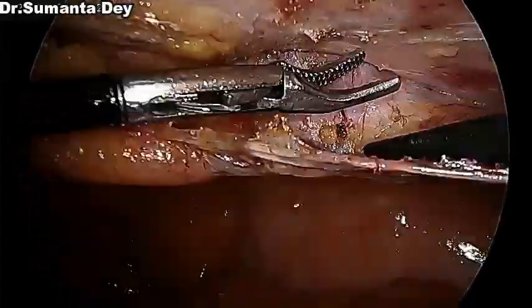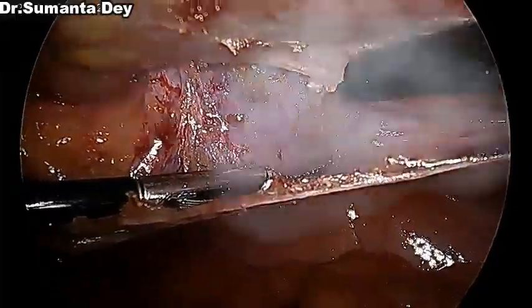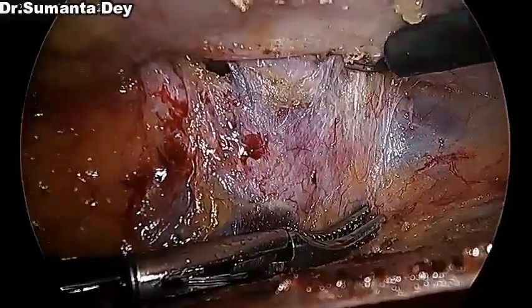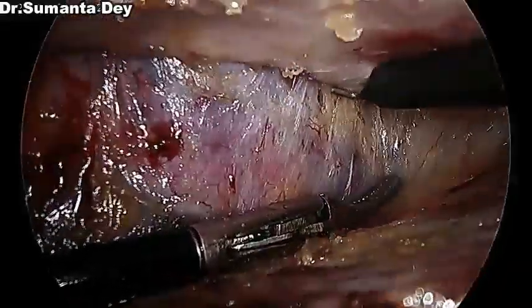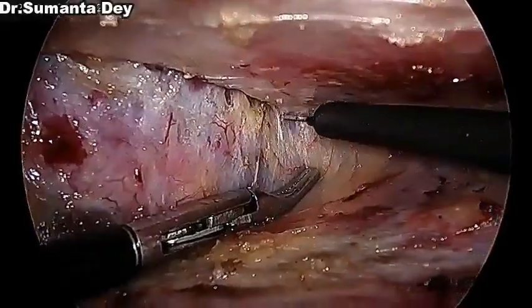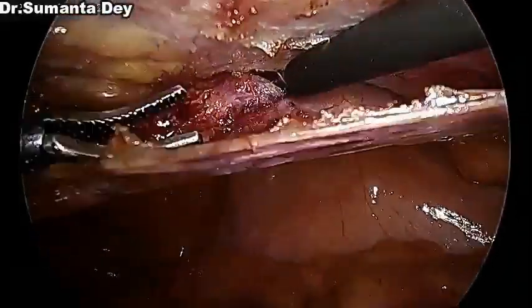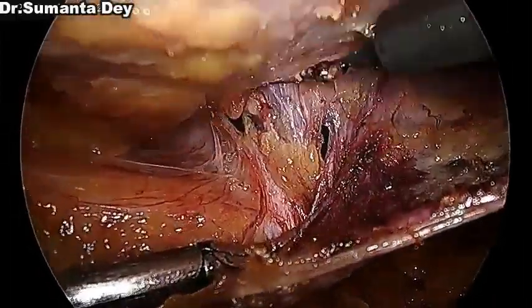as much of the hernial sac, that is the peritoneum, into the flap side, so that ultimately, as it's an incisional hernia, there will be some scarring, and there will be a rent in the peritoneal flap that I have to close. So I'm trying to buy as much peritoneum as possible from the sac part, so that while closing the defect, I'll find that there is enough peritoneum, and after closure there won't be any shortage of flap coverage.